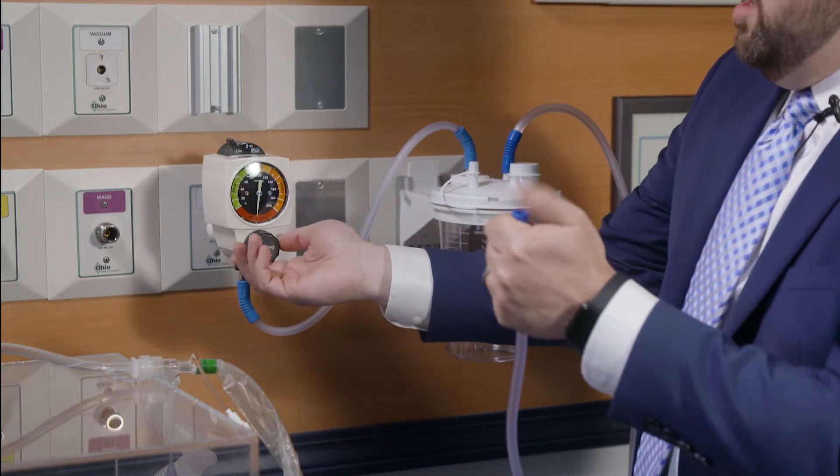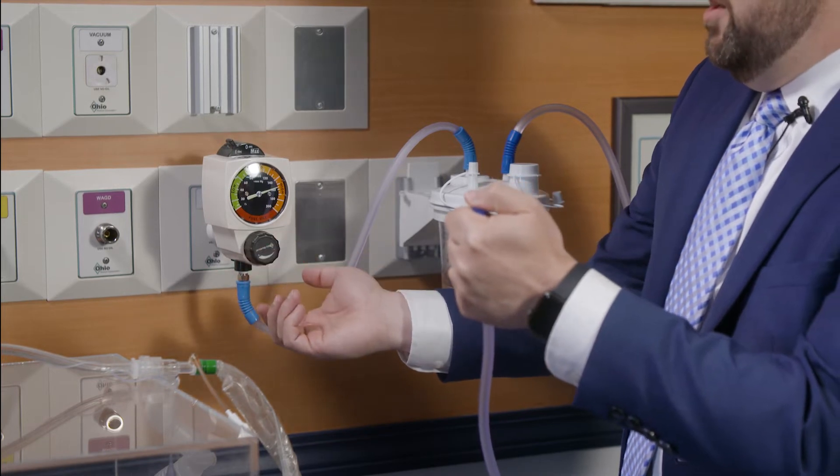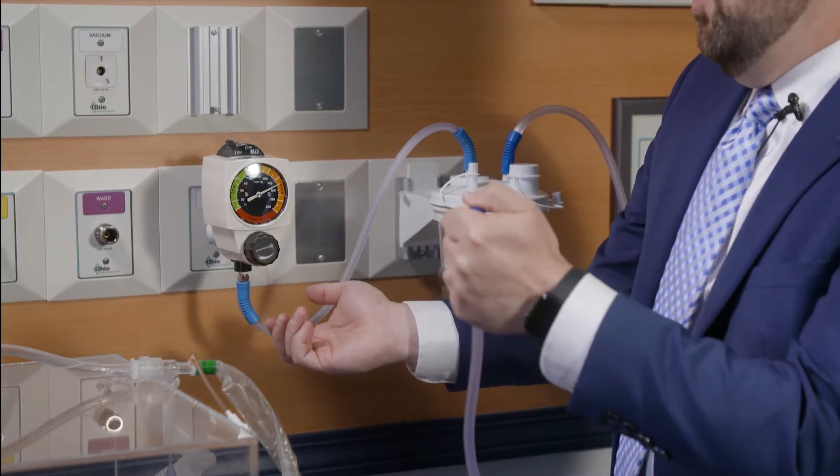Put your thumb over the end of the tubing and pulsate that as you're decreasing the pressure on the regulator to wherever it is that you want to go to.